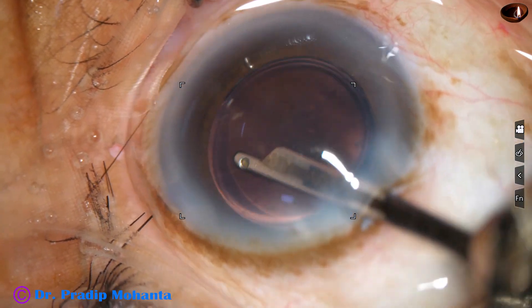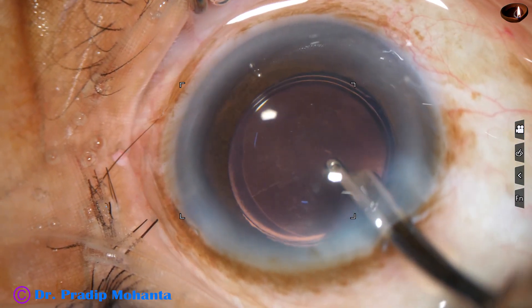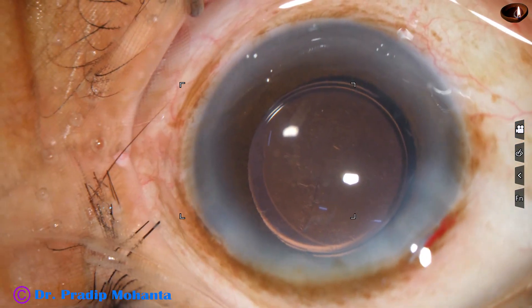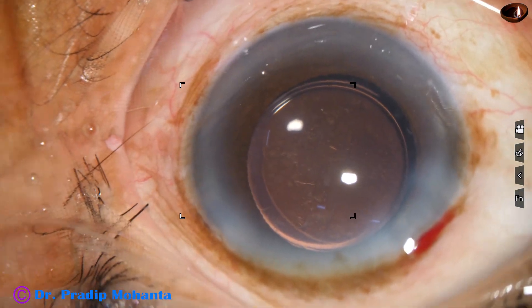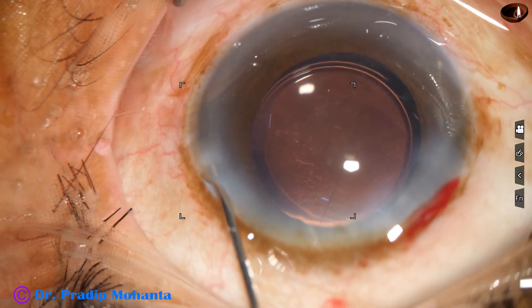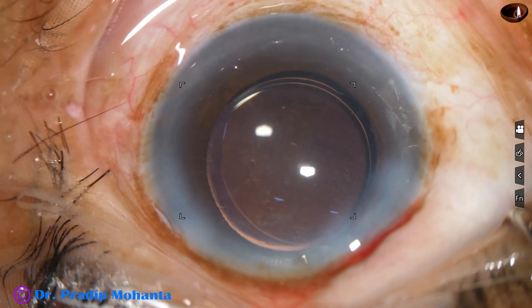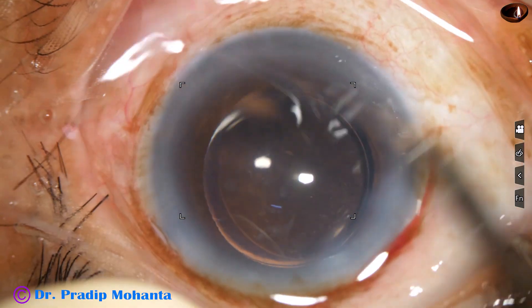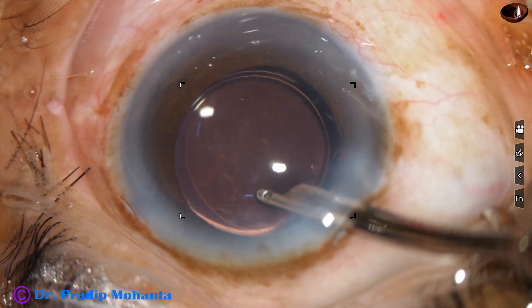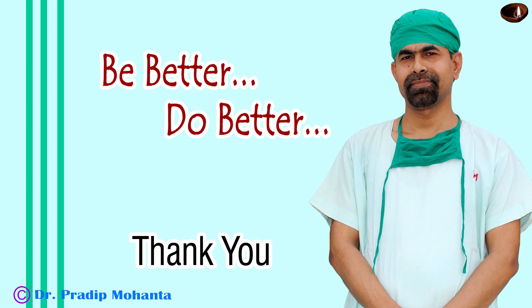We have done a good job in this 90-year-old gentleman. Even if the patient is very old and the cataract is very hard, it is possible to do a safe surgery. We can leave the last nuclear piece or last bit of epinuclear shell and remove it over the IOL scaffold. The side port is closed by corneal stromal hydration, and this is the final lavage of the anterior chamber. The anterior chamber is then formed very nicely and the case is concluded. Thank you very much for your attention. Hope this video will help you in developing your surgical skills.